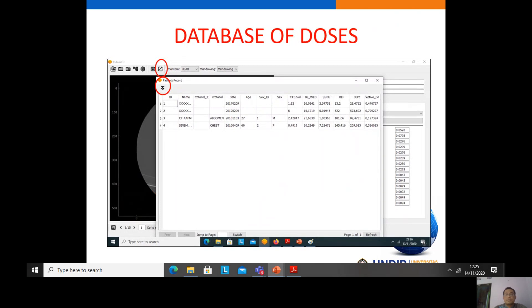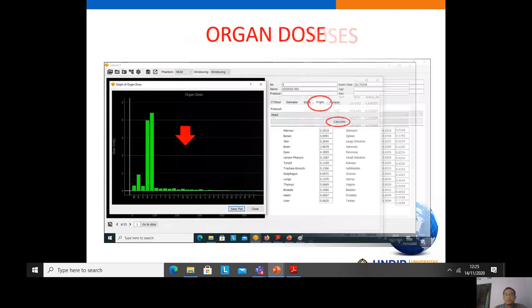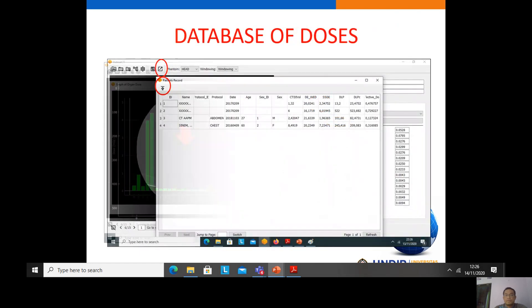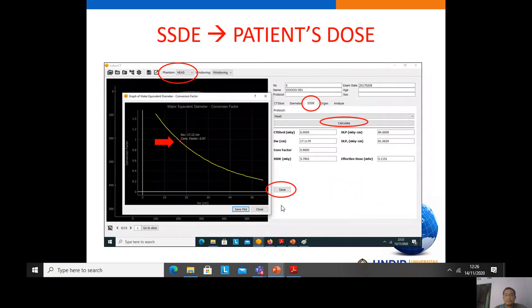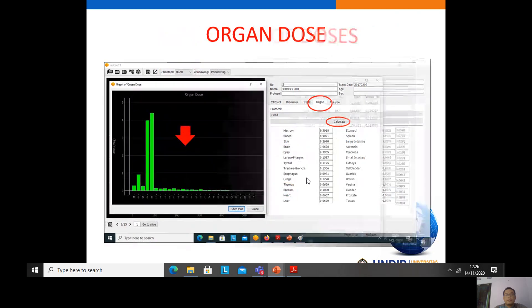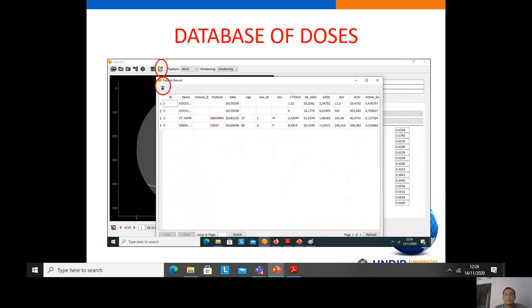The patient dose parameters — for example CTDIvol, water equivalent diameter, SSDE, DLP, effective dose, and so on — can be stored to the database using the Save button. This means the CTDIvol, diameter, and SSDE are stored and saved to the database. This database can be exported to Excel for further analysis.